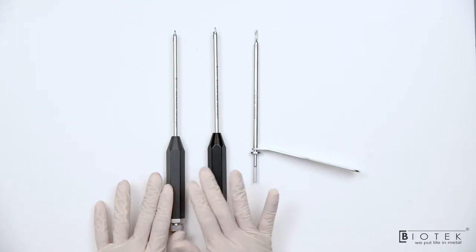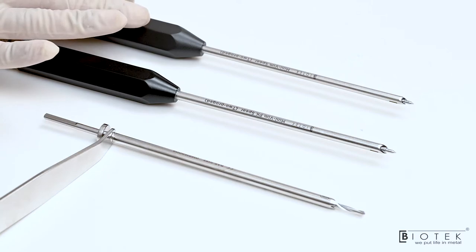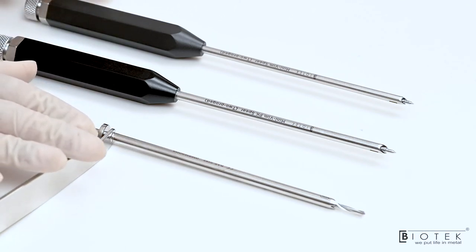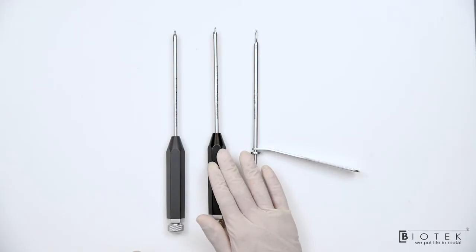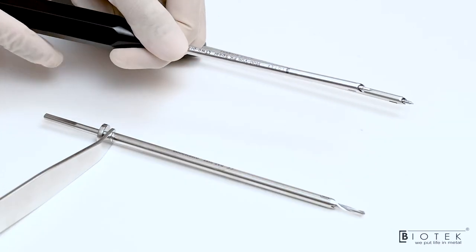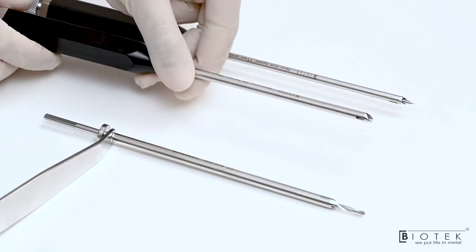These are spears for Bankart repair anchor insertion. This is for Mini-Revo, Mini-Revo PK and Mini-Revo PK knotless anchor. This is for 2.8 mm. This is 3 mm double-loaded suture anchor. This is 2 prong spear which is also available in fish mouth design.